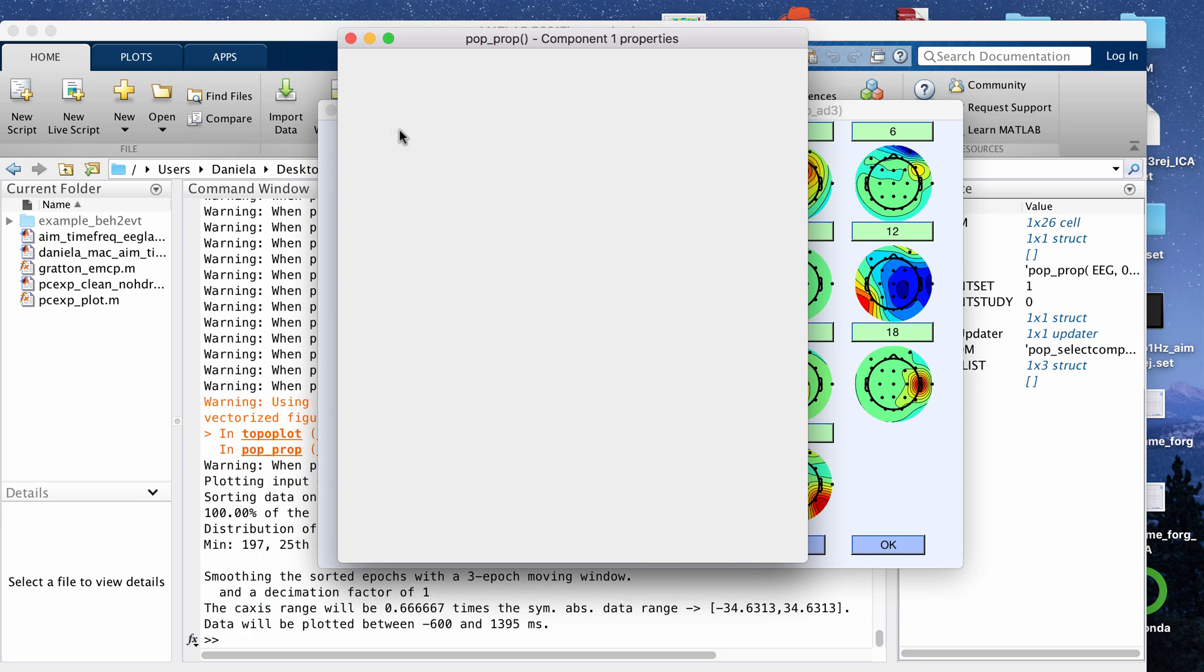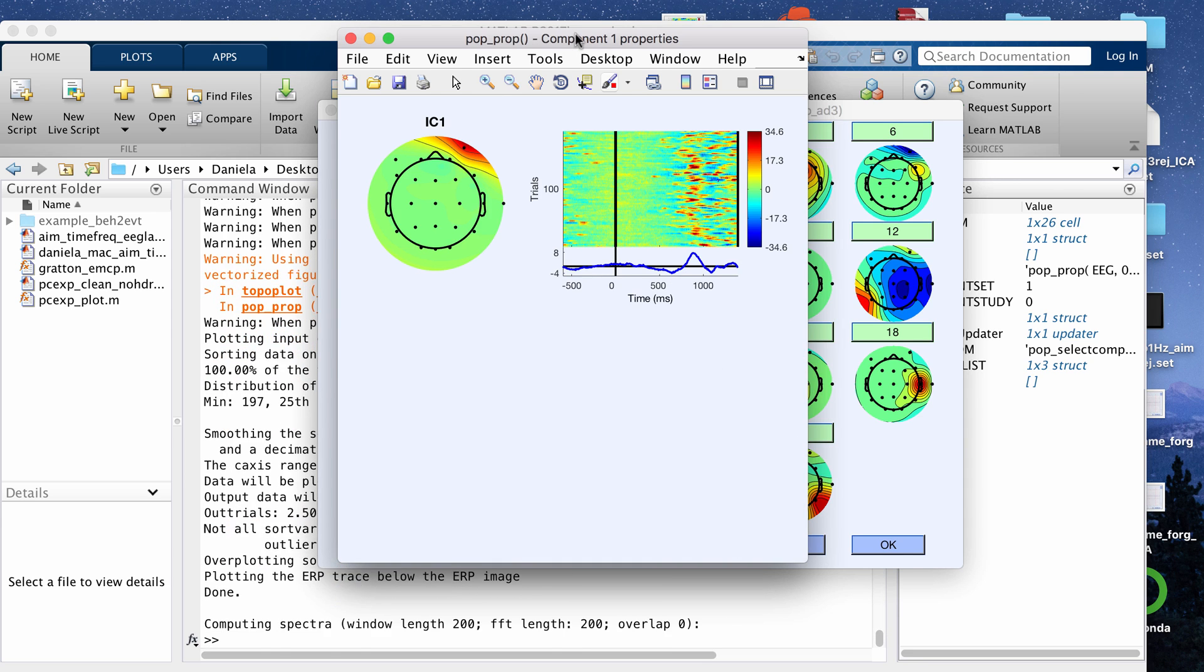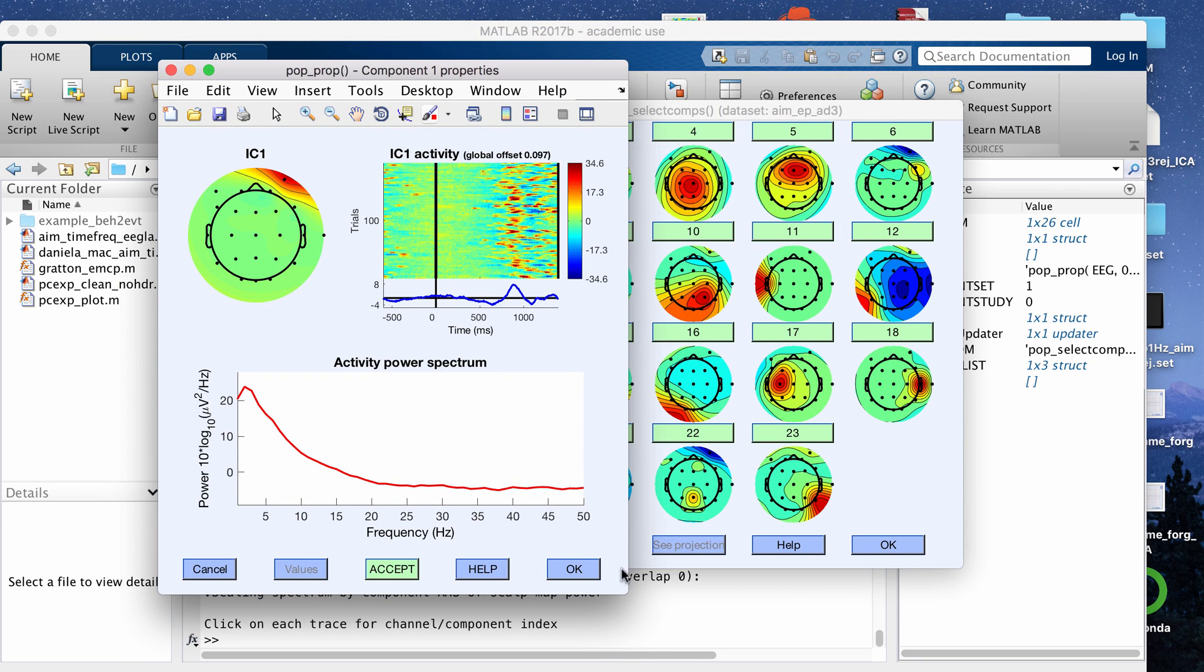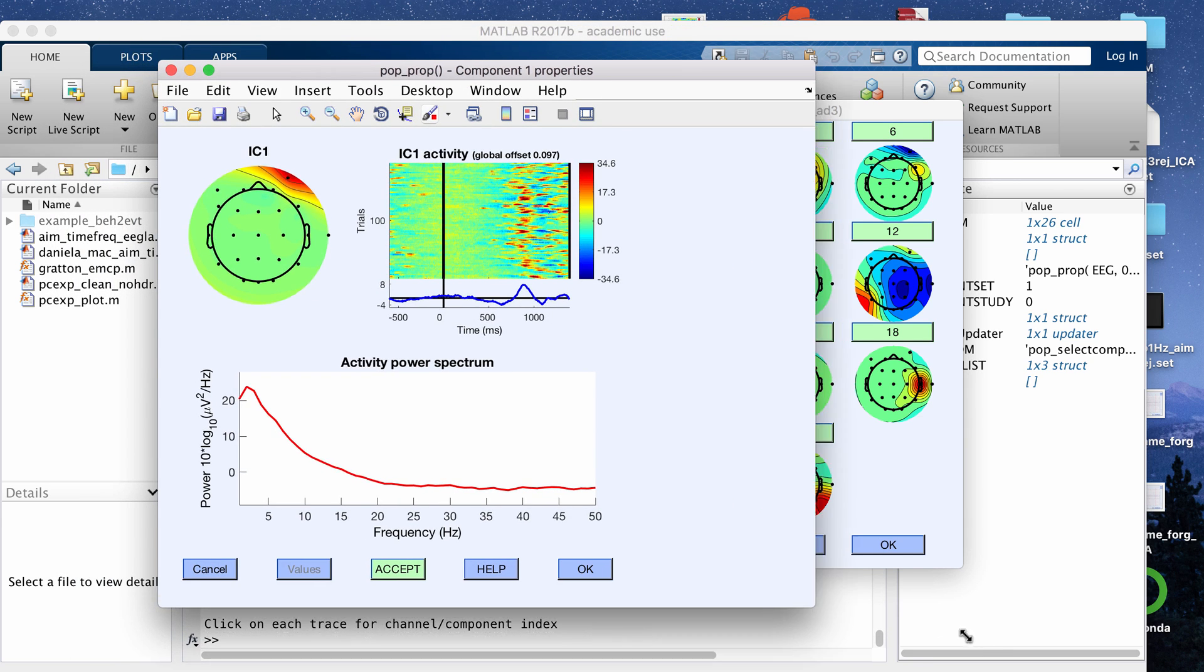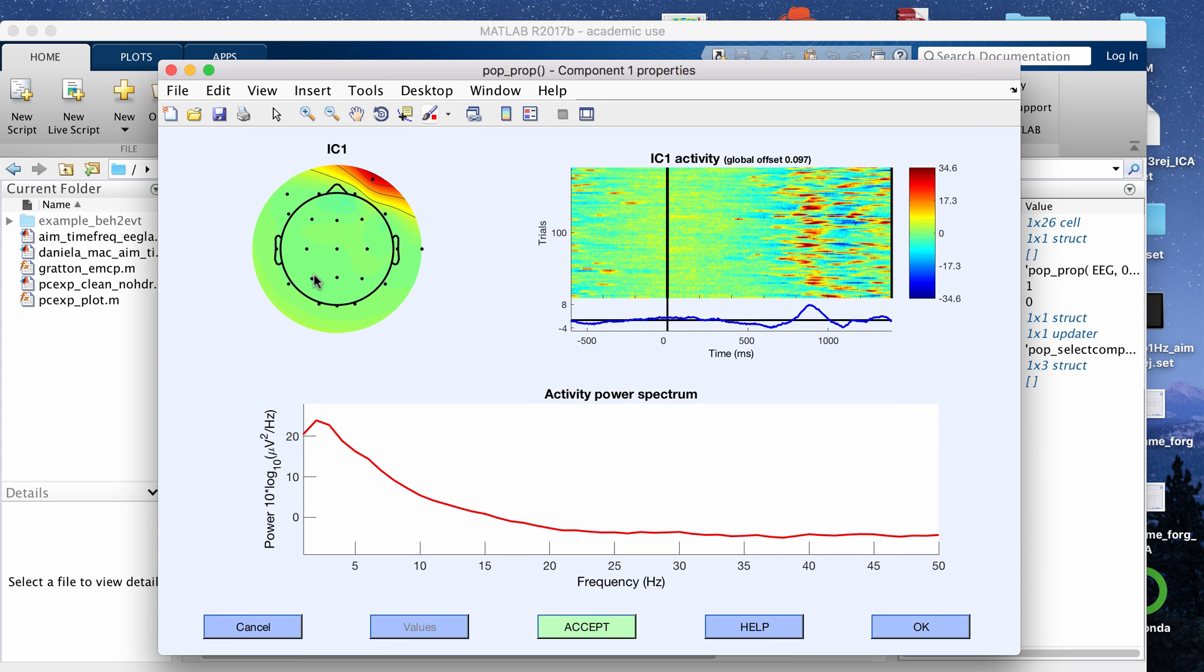If you click number one for example, this will open up another window that has a power plot, the individual topography map, and an ERP image, and an ERP.